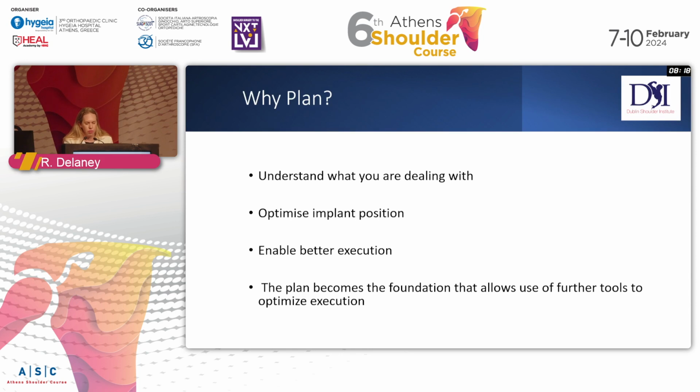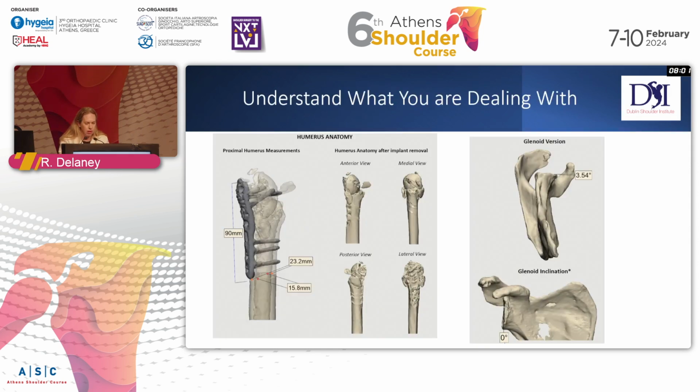Why use this software? I like to think about it in terms of understanding what I'm dealing with, and then also allowing me to optimize the implant position, help me execute better and translate my plan into the actual surgery. And then the plan is also the foundation that's allowing us then to use these further tools and enabling technologies.